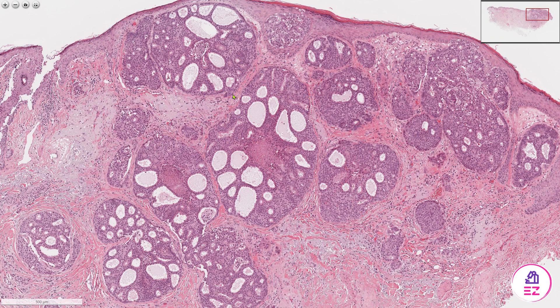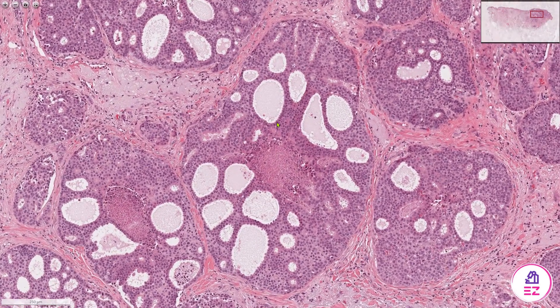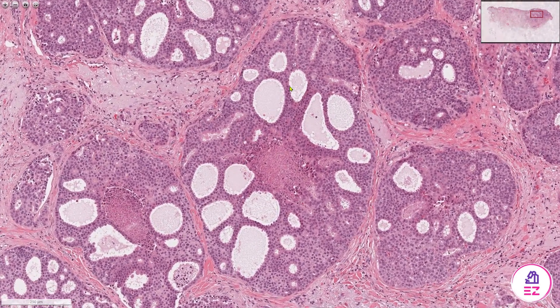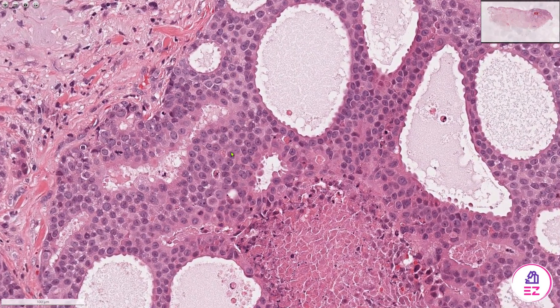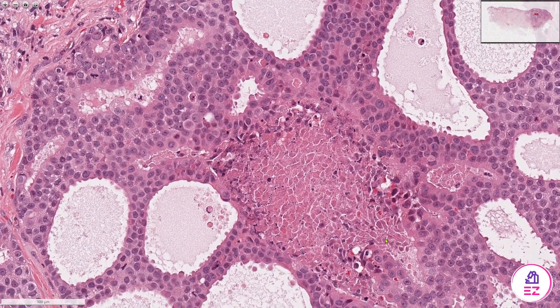What we can see is that we have solid nests and lobules of epithelial cells, and they definitely have a somewhat cribriform architecture with multiple cystic spaces dividing up these solid islands.